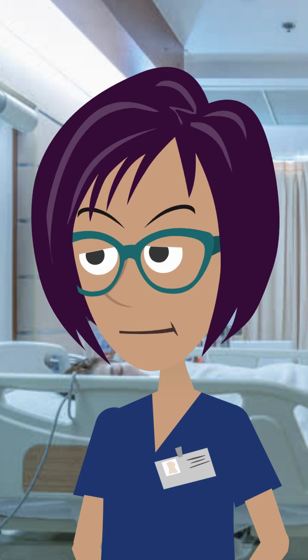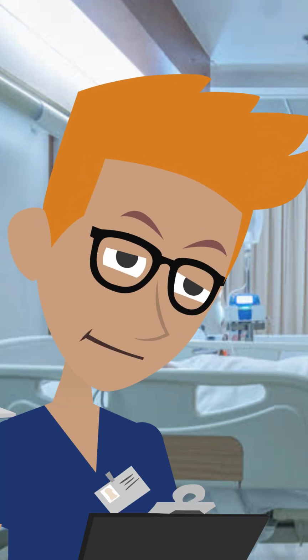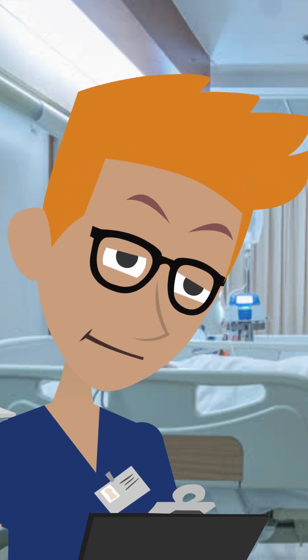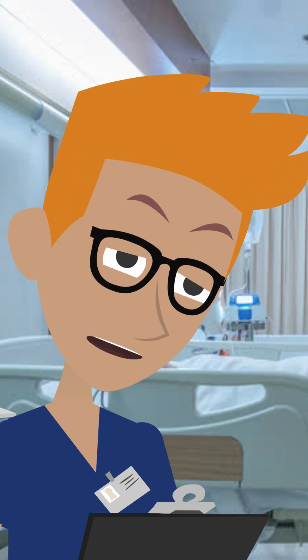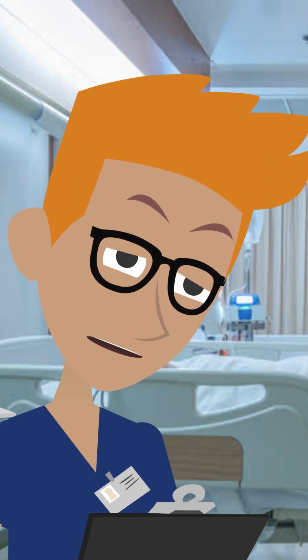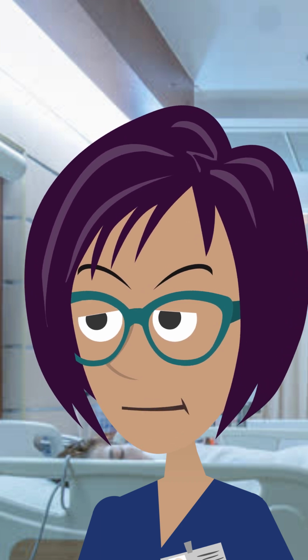Okay. Please make sure that the chest drain is always kept below chest level and the drain tube is always under the water level. All right. The drain bottle's in a bottle stand so it stays upright. Could you make sure that Mr. Aziz keeps the bottle below the level of his waist when he walks around? Okay. I'll make sure I tell him that.